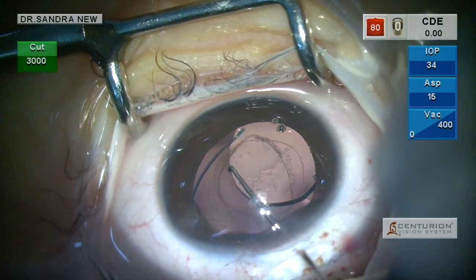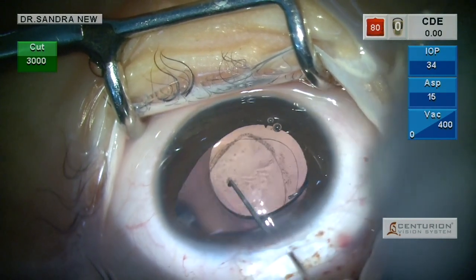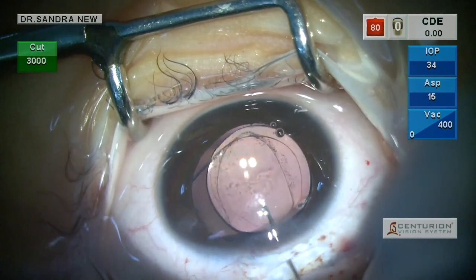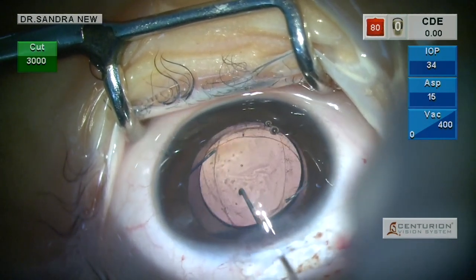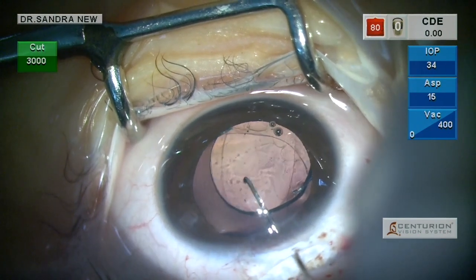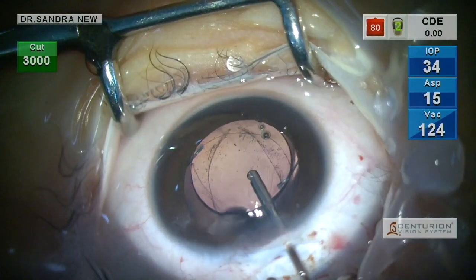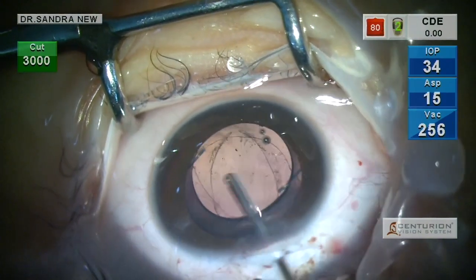That would help to position the lens well, prevent inflammation, and aid in centration. You can see that I am now optic capturing the optic under the anterior capsular margin. The lens is now safe and secure with just the haptics in the sulcus.